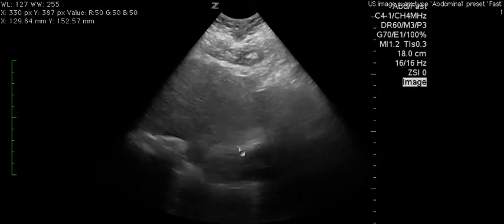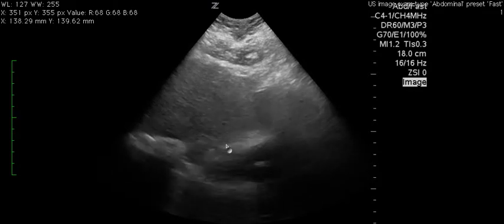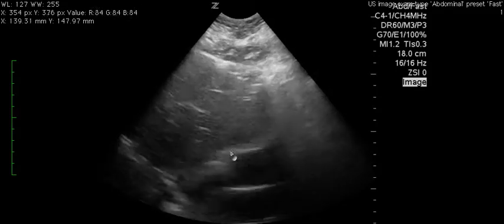You need to increase your depth. You've got to see behind the heart — you can't just see the interface between the liver and the heart. You need to go deeper so you can really get a good view and see if there's any free fluid, and the same applies to this view that was saved.